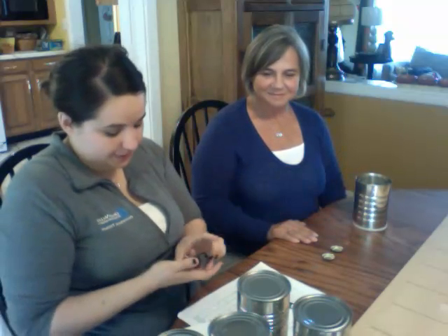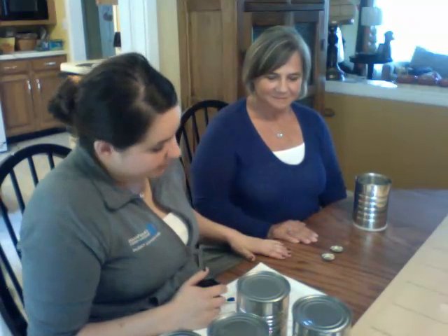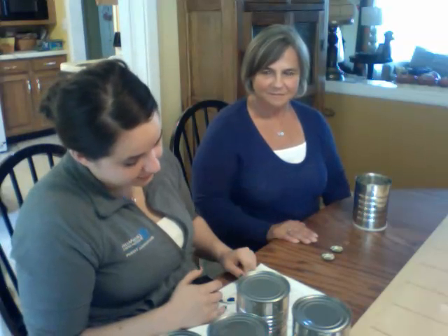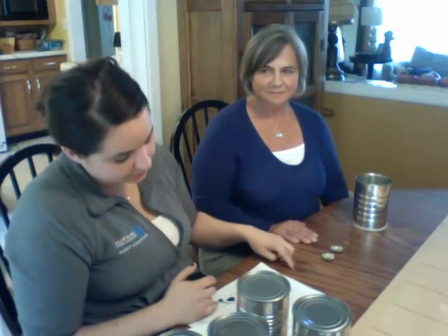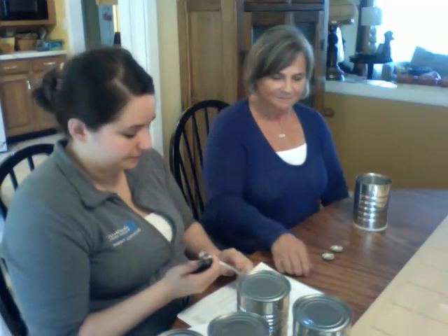All right, let me get my little handy-dandy stopwatch started. All right, so place your left hand on the table, and when I say go, use your left hand to pick up these objects and place them in the can as fast as you can, beginning with this one, okay? Do you understand? Yes. All righty. Ready? Go.